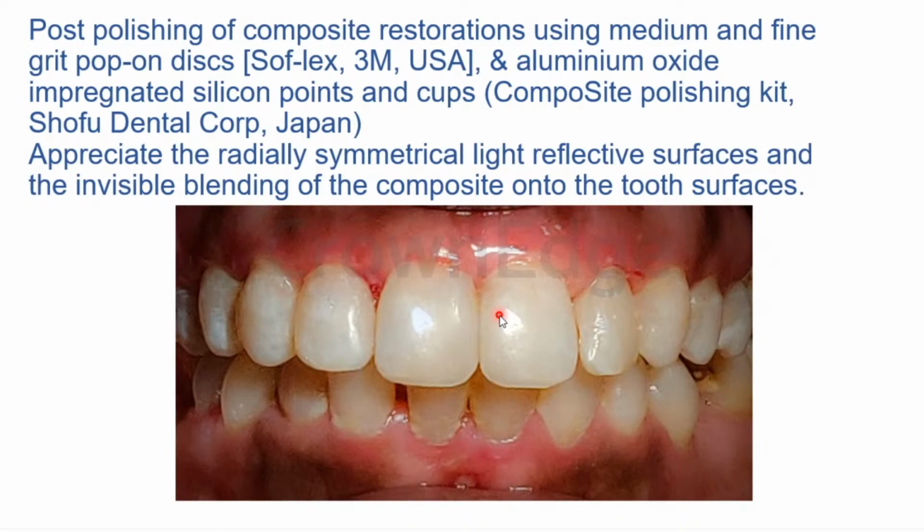Fifth generation is a separate etchant, with primer and bonding in a single bottle. So it is called two-step, all right? It's not three-step. We are skipping the separate primer step, going directly with primer and bonding in a single bottle. So this is also etch and rinse. You cannot etch and stop and go ahead with bonding agent. You understood? It is called etch and rinse.